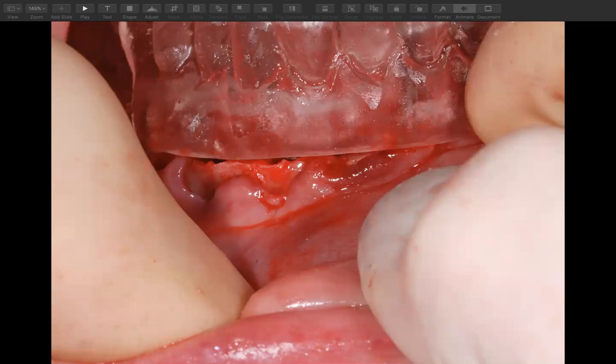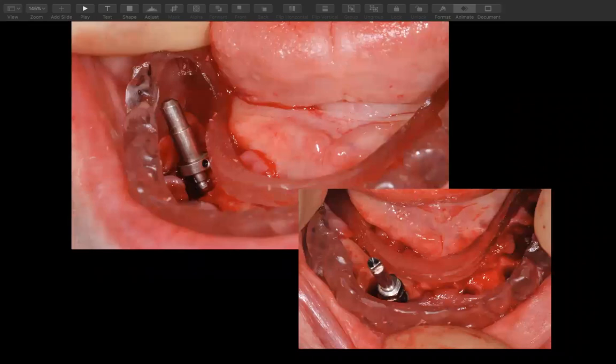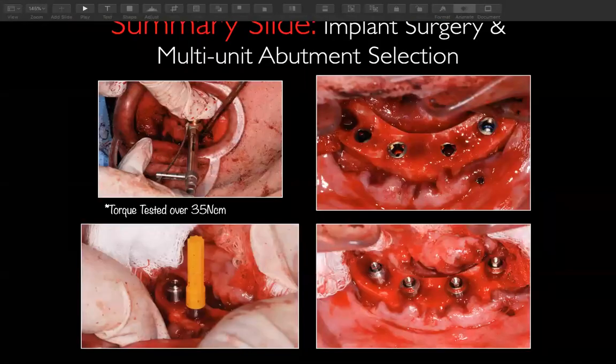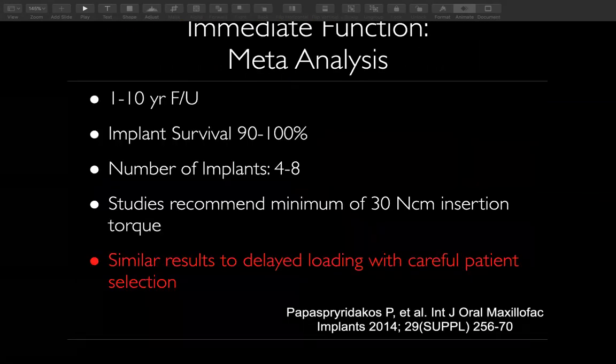Here, this is that flange, again showing where we are for our bone height. This is a pin I put in the implant to show our angulation, to help us decide: are we going to put in a straight multi-unit abutment that goes on top of these, or are we going to use an angled multi-unit abutment? And I'll show you that too. In this particular case, these were straights that they used. On the bottom right, you can see the 4 there. Those are all straight abutments. And you'll notice, especially with the Nobel, the yellow handle is for straight, and the multi-unit angled abutments will have a metal handle, and I'll show you that too.